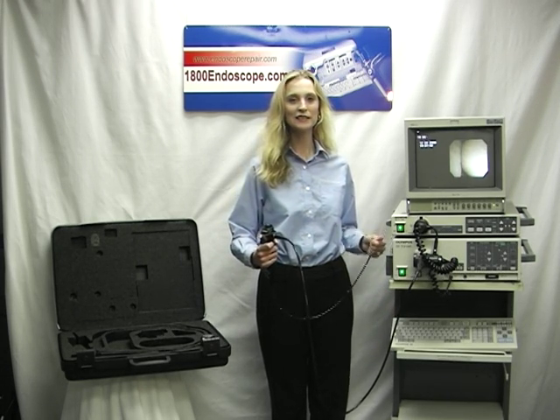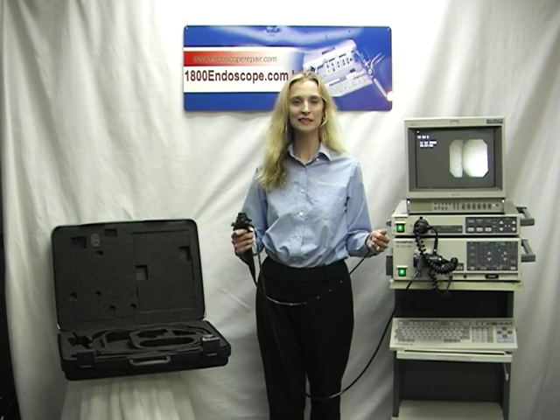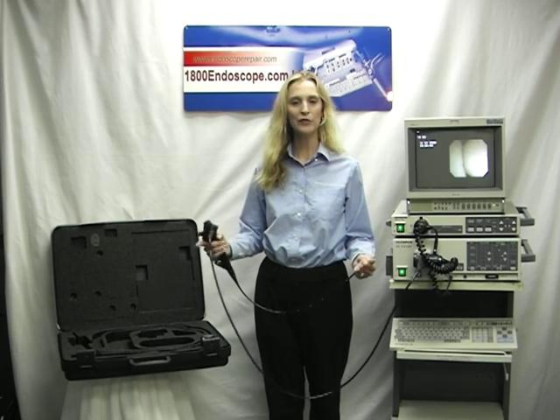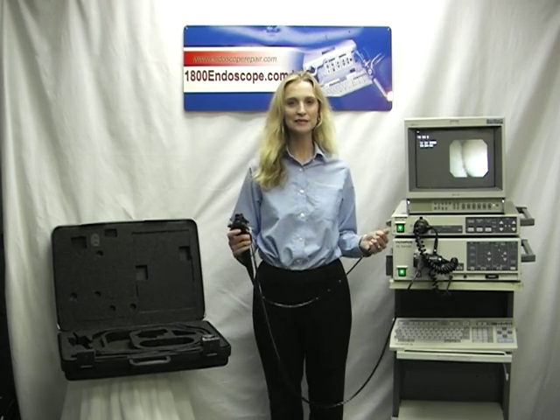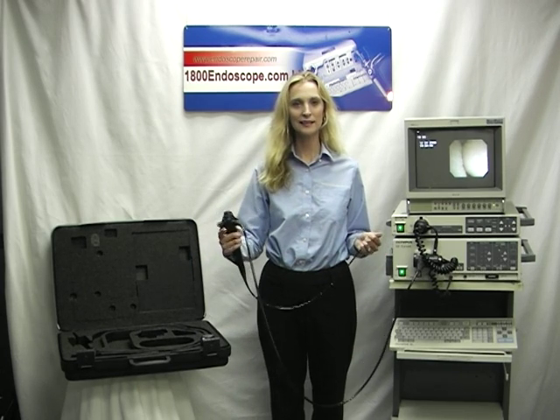un teclado Olympus, a bronchoscope, un bronchoscopio. Each bronchoscope includes a case, valves, and cap. Cada bronchoscopio incluye un maletín, válvula, y tapón.